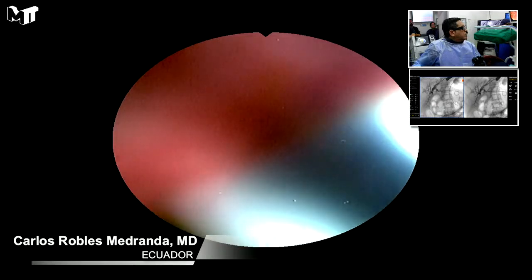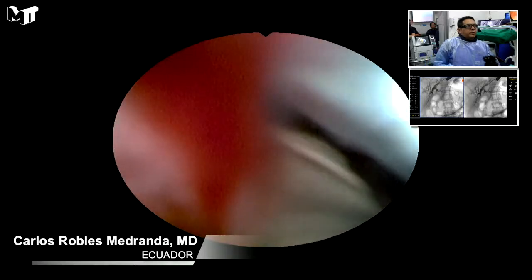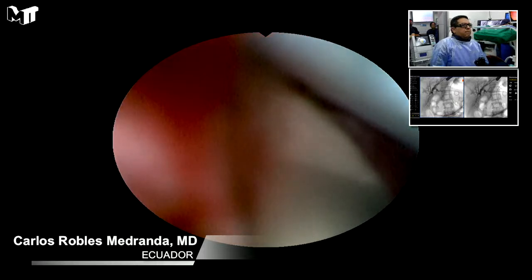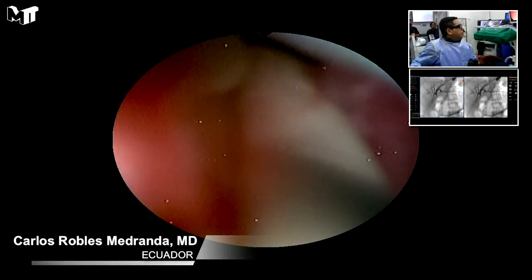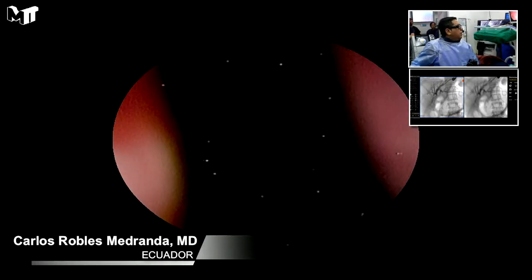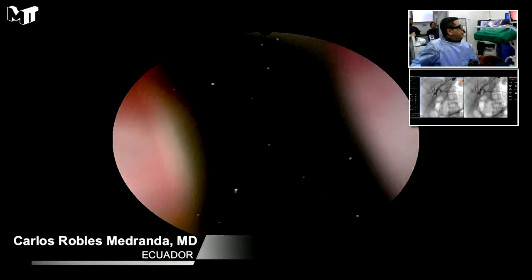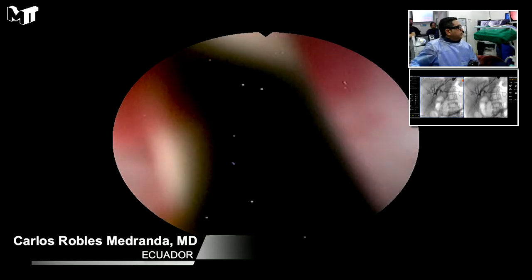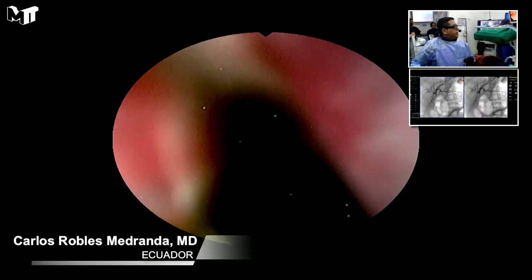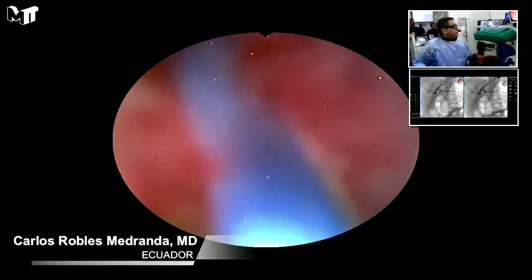I believe we are right. We are very nice here. So I need to establish this communication now. No sé si puedes empujar. Right, perfect. You see? So now I'm very good now. Now I'm sure that I have a connection now. So push, empuja. I have a connection now with the right side.